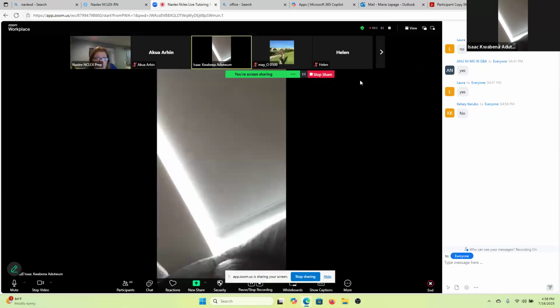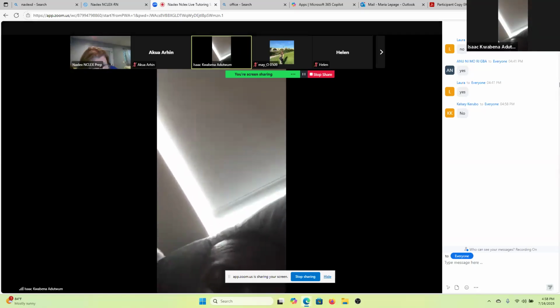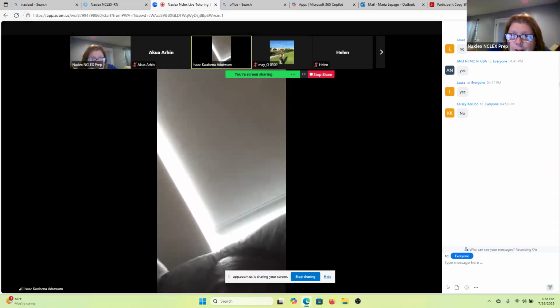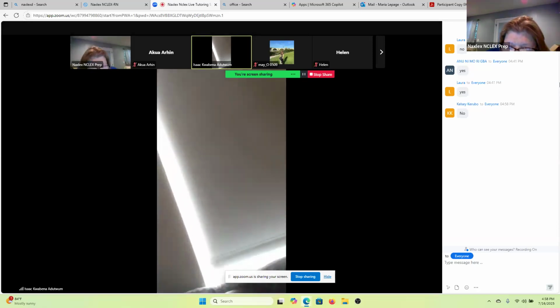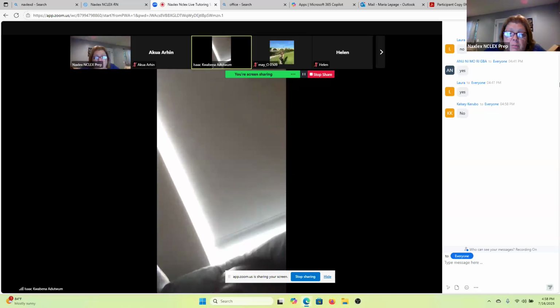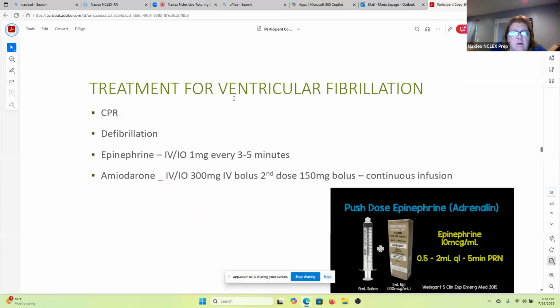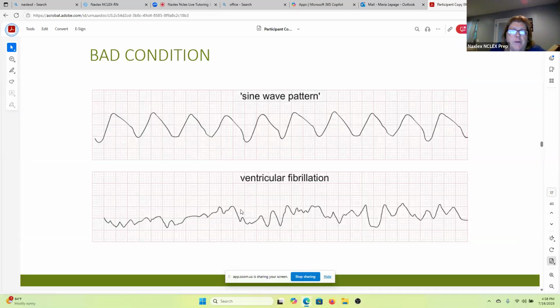I want to know what is shockable rhythm and non-shockable rhythm. Shockable rhythm. I'm having a really hard time hearing you. Oh, a shockable rhythm? Yes, please. So the only shockable rhythm is ventricular fibrillation, which is this rhythm here, this bottom one, ventricular fibrillation. That is the only shockable rhythm. We can cardiovert, which is where we deliver electricity, but it's not at the same number of joules or amount of electricity that you would defibrillate somebody with.